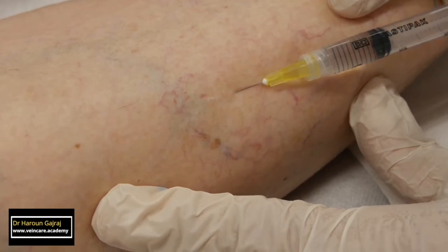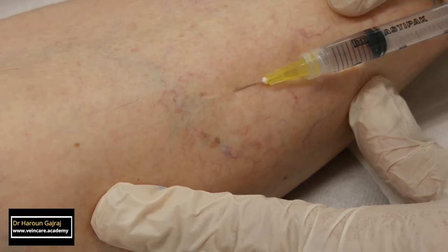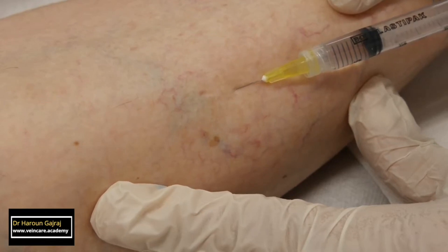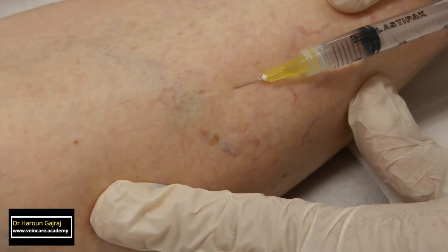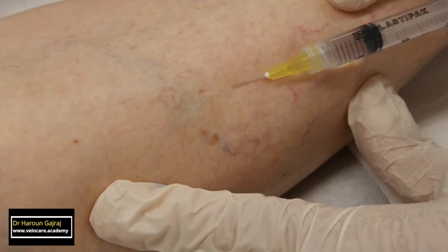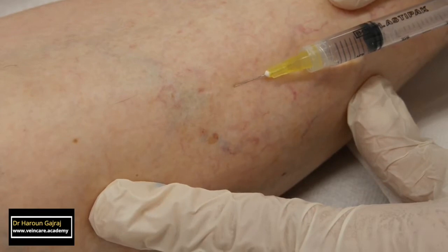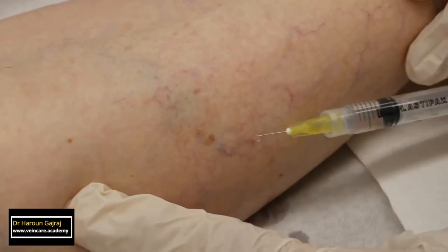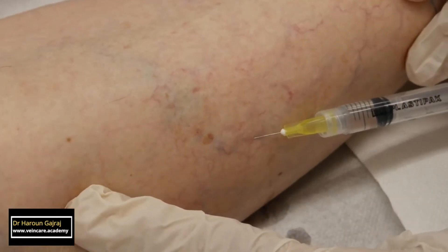Notice that I am injecting small amounts of sclerosant, slowly, under low pressure. Before I withdraw the needle, I hold the piston of the syringe still for a few seconds. This allows more contact time between the sclerosant and the endothelium before the sclerosant is deactivated by the return of blood into the vessels. Some experts suggest that this improves endothelial destruction.